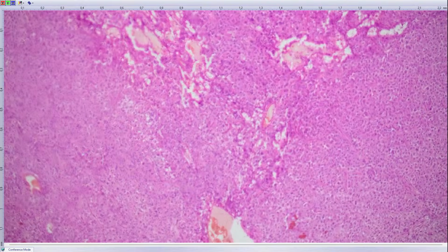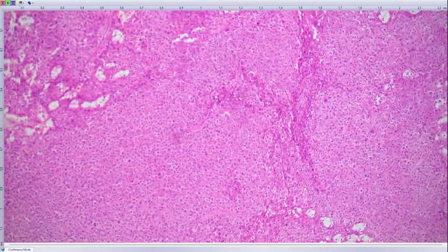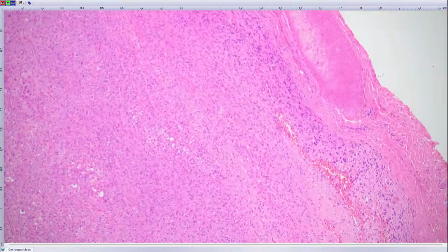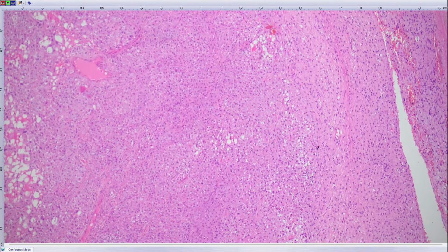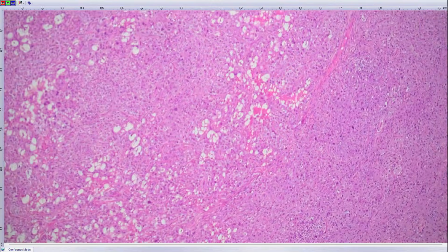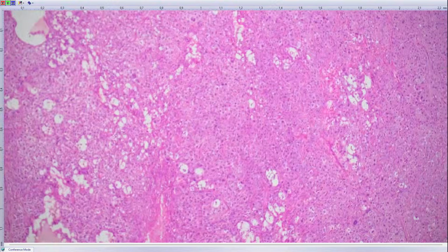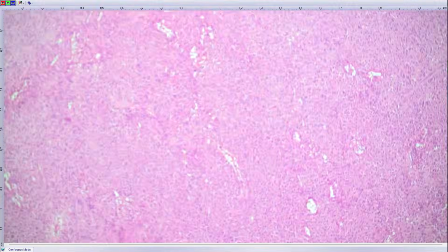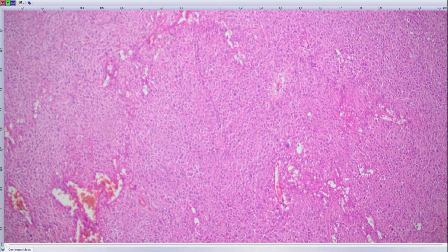So here is quite a broad differential diagnosis, of course. You can even think of some carcinomas given the epithelioid morphology, but that's unlikely because if you had a carcinoma like this, it would be in the wall of the intestine. There would be some mucosal involvement as well, which wasn't the case here, and carcinomas with this kind of pleomorphism would have very high mitotic activity, which was not the case here.